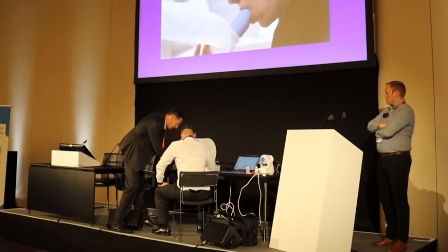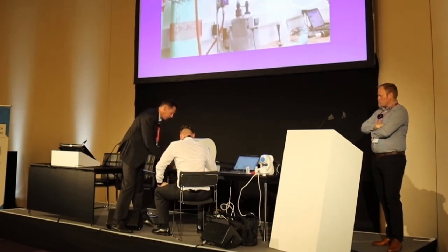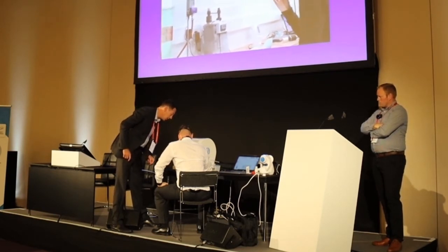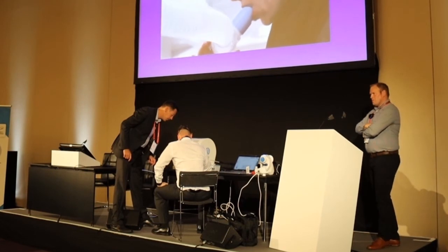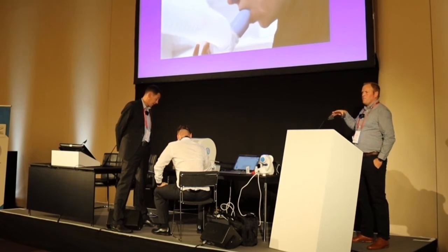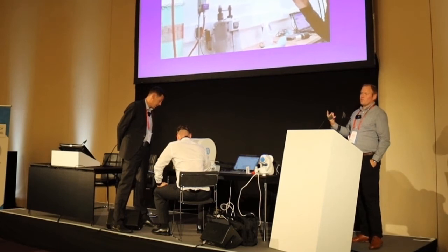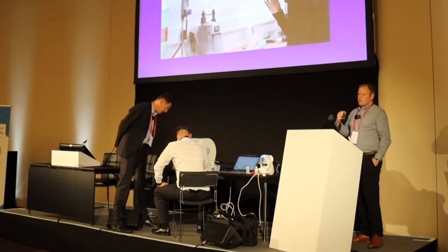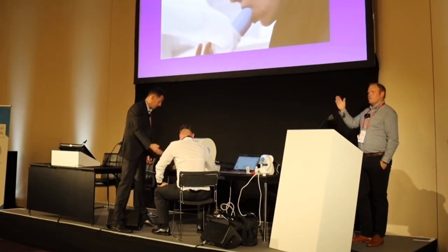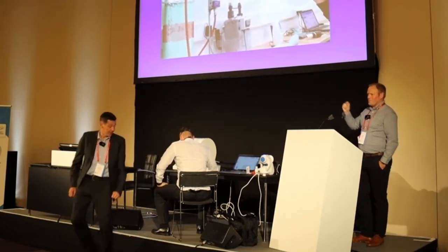I'm just setting up the target ventilation, so it's 130 liters per minute for him. Let's start the test. Okay. Benjamin's resting FEV1 was around 4.4 litres, and when we times that by 30, we get to approximately 130 litres per minute. What we tend to do is set the ventilation target within units of 10, because it's a bit difficult to get specifically to 1 litre.